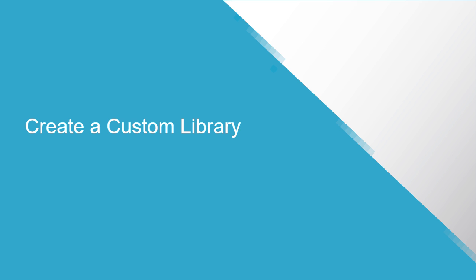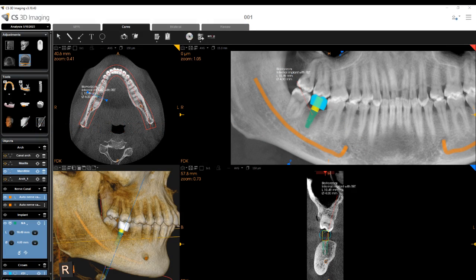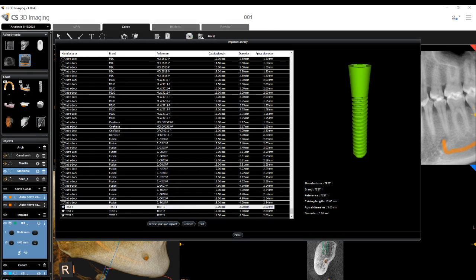Create a Custom Library: Create a custom library to transfer implants you have created to additional CS3D Imaging workstations. After you have created your implants, export the custom library zip file. Then you can import the library zip file to other CS3D Imaging workstations.